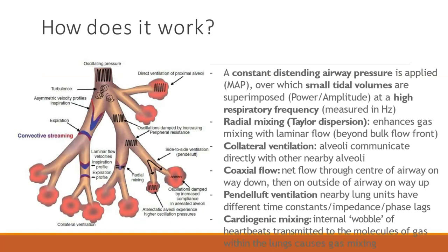Okay, this is a little bit of a busy slide. Let's try to go over how it works. There's a constant distending airway pressure, kind of like a PEEP. And that's going to be our MAP, which is going to keep the lungs three-quarters-ish inflated, right? So the lungs are never going to deflate. And then these small tidal volumes are superimposed, per se, at the high frequency, crazy high frequency.